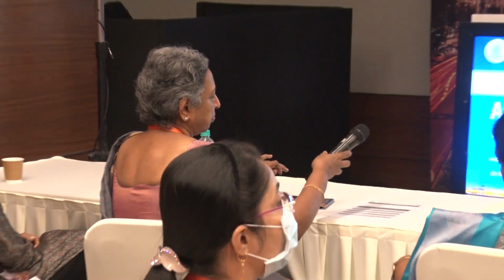Thank you very much. I have one question to Dr. Satyan. What would you say is the relevance of the disc damage likelihood scale for resident training? How would it differentiate them? It's a difficult question for me to answer, because I'm not sure how many of us really follow the DDLS scoring system, but with the advent of other methods like OCT with BMO, I think we will be going to the next level rather than just looking only at that. But the importance is that a small disc with a small cup is important, while a large disc with a large cup may not have glaucoma. So that is one thing which we can really look at.